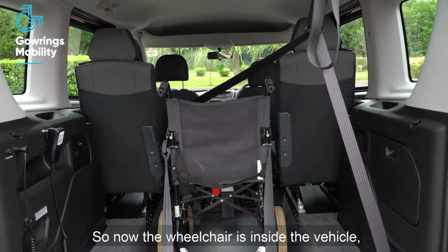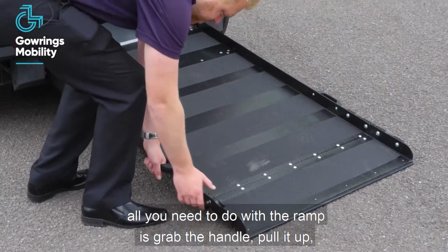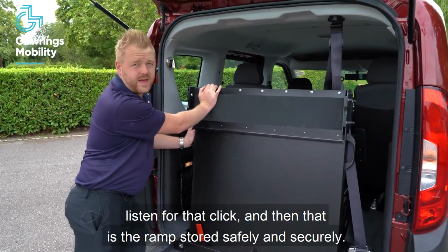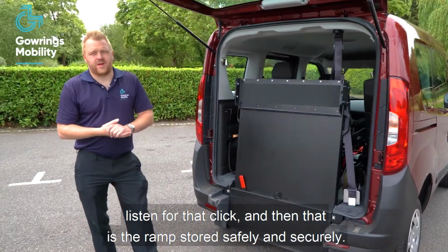So now the wheelchair is inside the vehicle. All you need to do with the ramp is grab the handle, pull it up, push the flap over, push it in, listen for that click, and then that is the ramp stored nice, safely and securely.